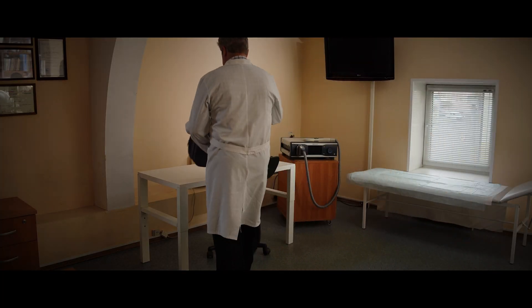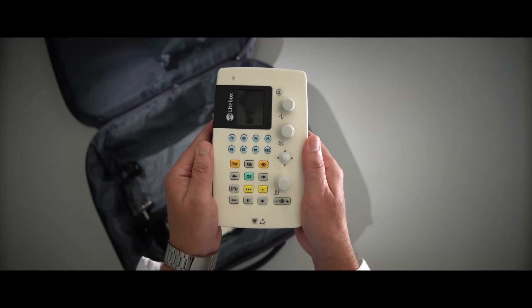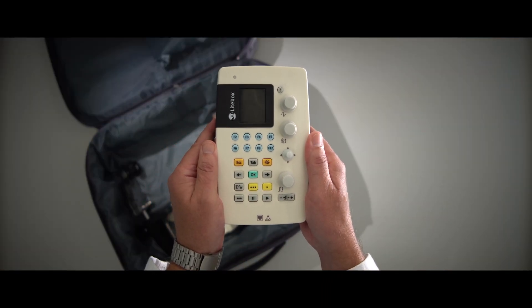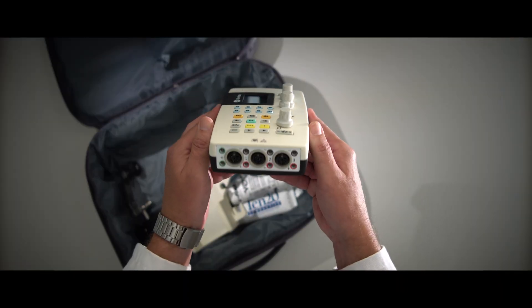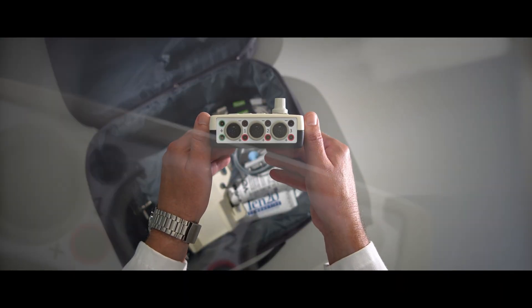The examination performance depends that much on the quality of the equipment used. Here is Lightbox, a three-channel system for nerve conduction study, electromyography and evoked potential acquisition.